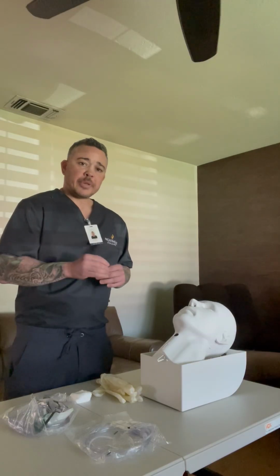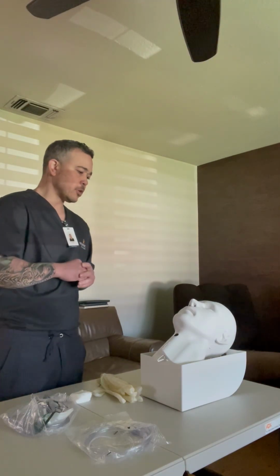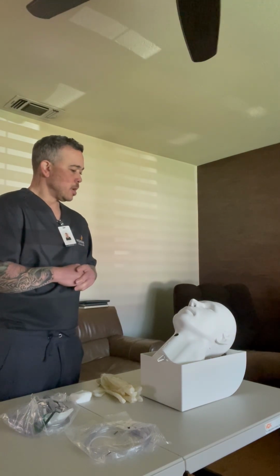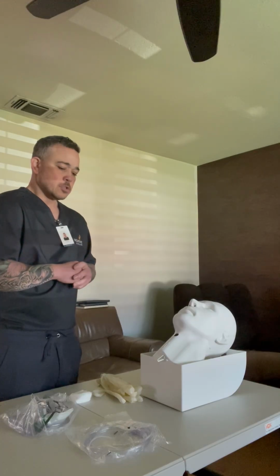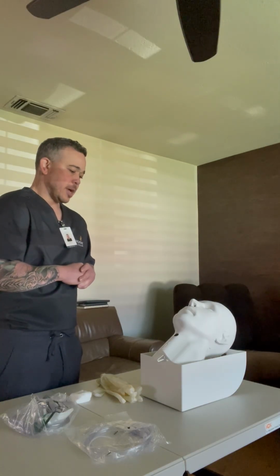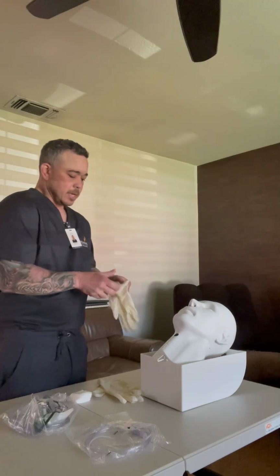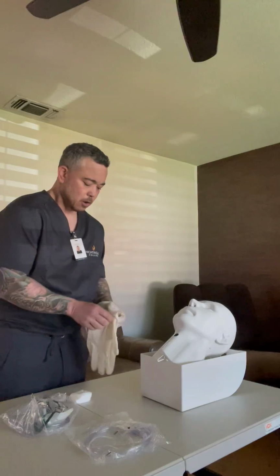The next thing I'm gonna do is explain to the patient what we're going to do next. Okay, Mr. Smith, we're gonna go ahead and do an oxygen therapy. Your doctor has ordered some oxygen for you. Apparently your oxygen levels are a little low. So what we're gonna do is apply a nasal cannula and begin the oxygen, okay? So the next thing I'm gonna do is go ahead and put on my gloves. And at any time during this process, if you have any questions, sir, go ahead and ask away.